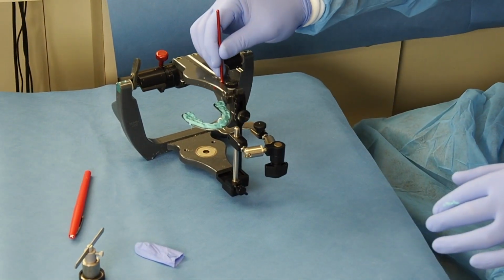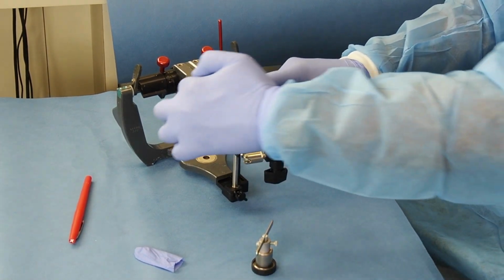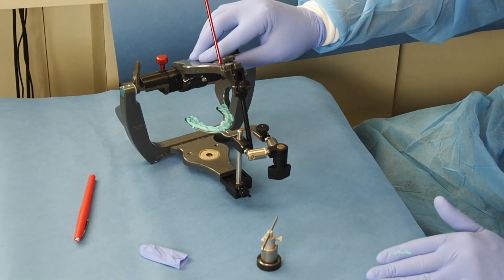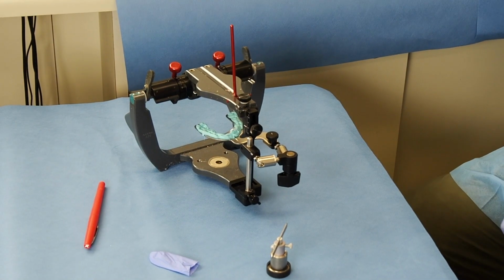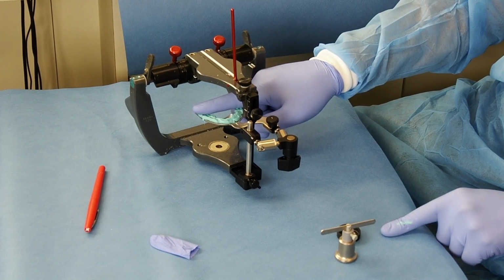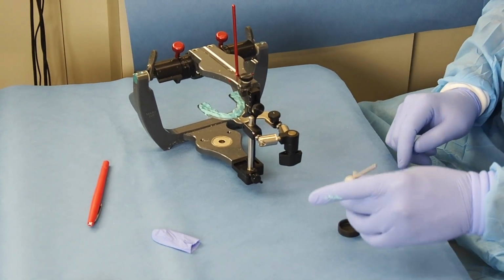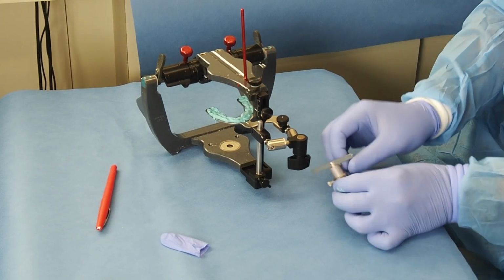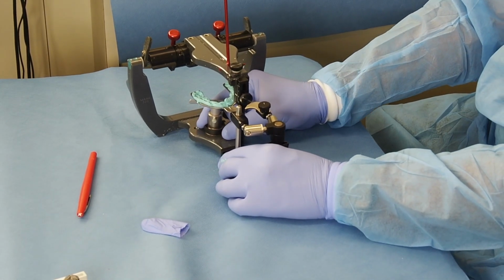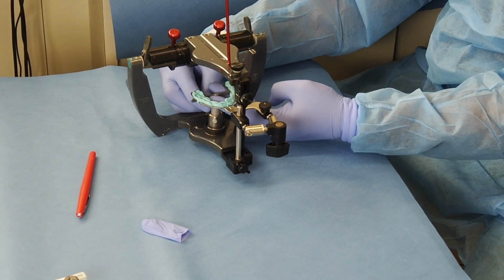So now I have these, and it sits right there, right? Now I will be able to place the cast in here, have a mounting plate here, and be able to mount the upper, just like if you were using a universal mounting table. Sometimes this thing can be a little not very sturdy, a little bouncy, right? I will use my helicopter, and I'm going to place it right here on the magnetic part, raise it up, and then tighten it like that.